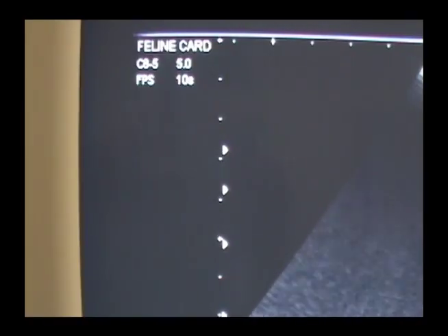In abdominal ultrasound, it is best to use 2 or 3 focal points. Focal points should be placed at the bottom and center of the target organ or lesion. Some ultrasound machines automatically control the number and position of focal points for you as you increase and decrease depth.